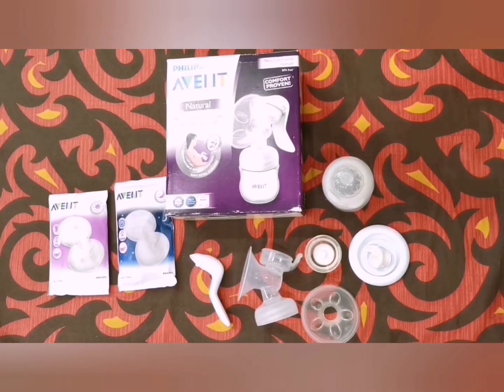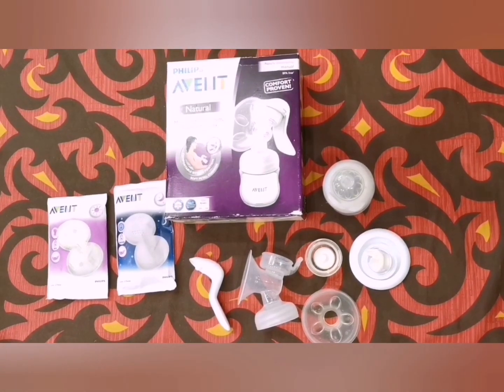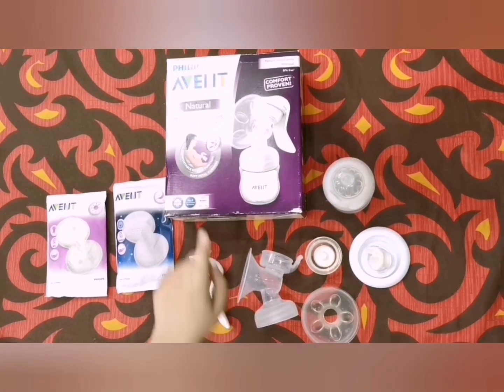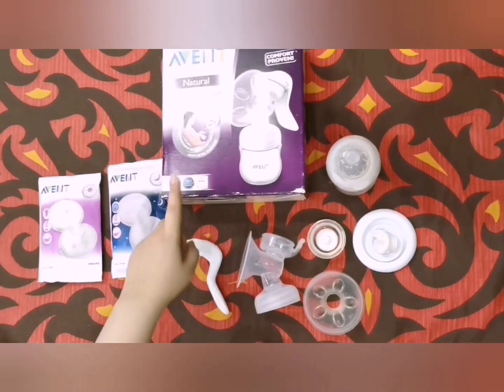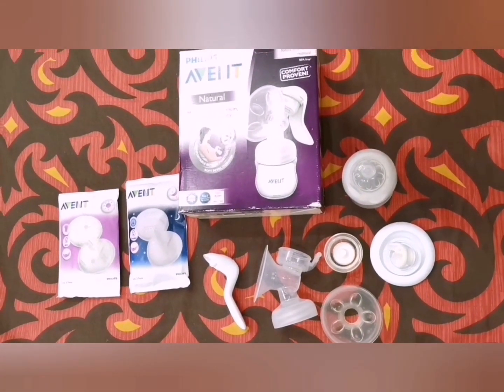Hello and welcome to today's video. Today I've sat down to talk about the Philips Avent breast pump. This is a manual breast pump. I'll share the products that come with it and then show how to assemble it.